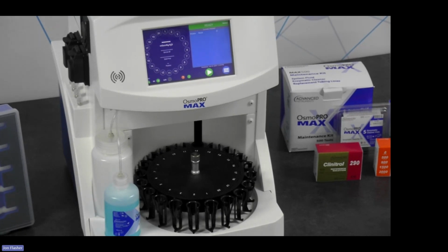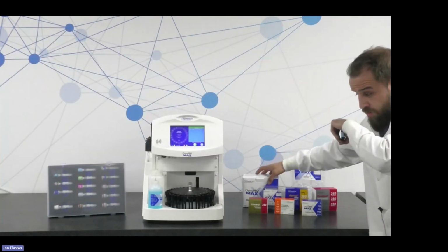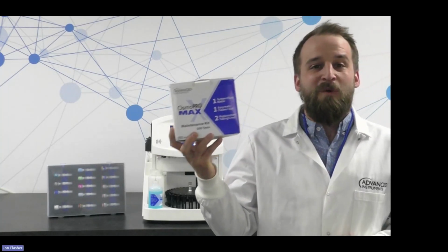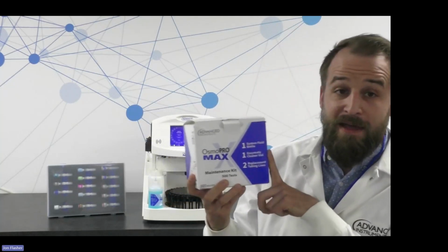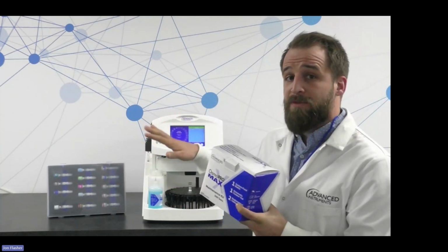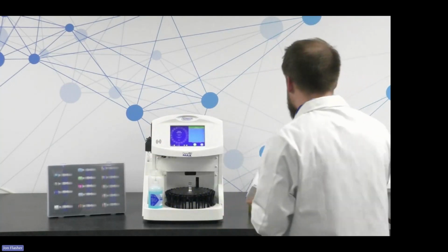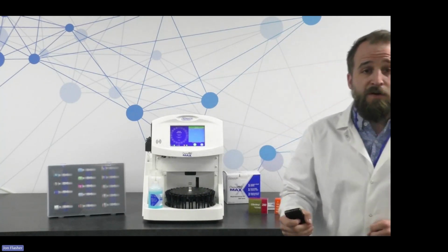As tests finish on the turntable, you can offload samples and load more samples. And you can keep doing this until you hit up to 500 tests. And then once you hit that 500 test mark, you'll perform what's called a Max 500 kit. And what's in the Max 500 kit is a bottle of system fluid, a vial of enzymatic cleaner for cleaning out the fluidic pathway in the sample chamber on the instrument, and 2 peristaltic pump replacement lines. So this is really your primary consumable that you're going to be using for performing your 500 test maintenance.